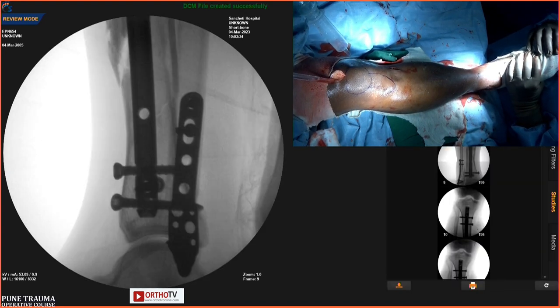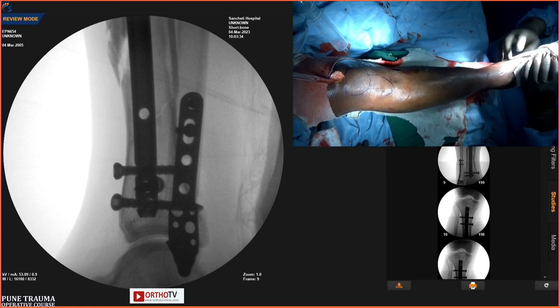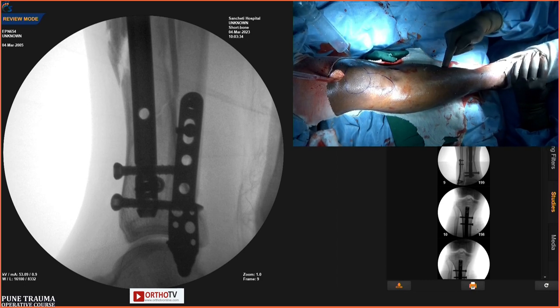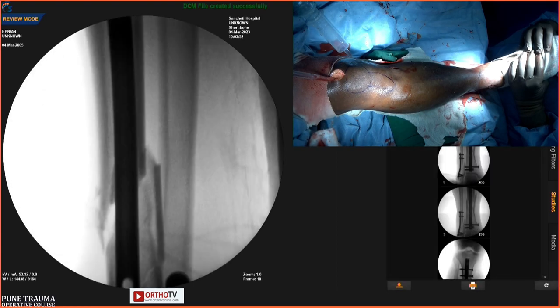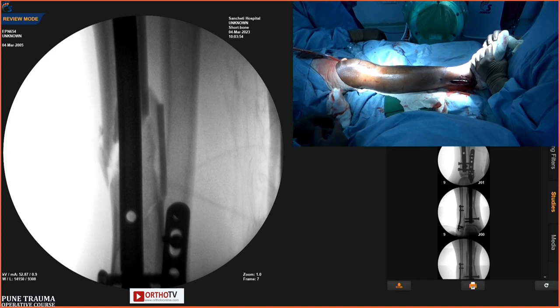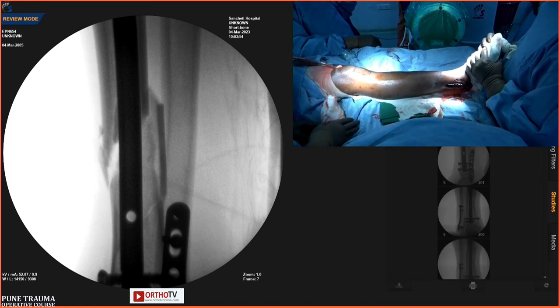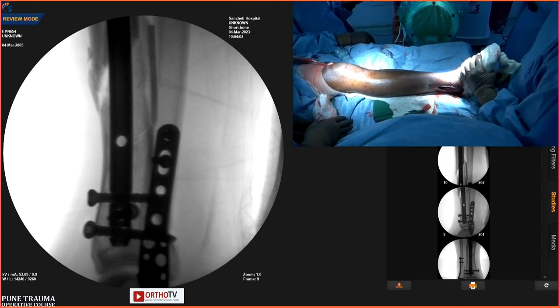And you can see here now, this is how it is aligned. Even in the lateral picture, you can see the curve of the tibial plafond is maintained. And you can see the fracture site also. These comminuted pieces heal around the nail. There is no issue because they are attached with the osteoperiosteal sleeve. This gap will also heal up. If you want to do some dynamization, you can do it after 3 months, but it is not required because the fibula is already fixed.